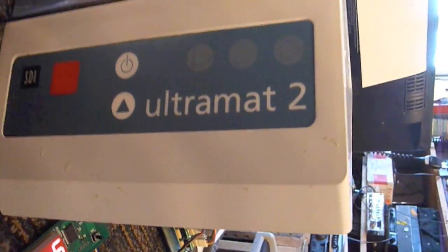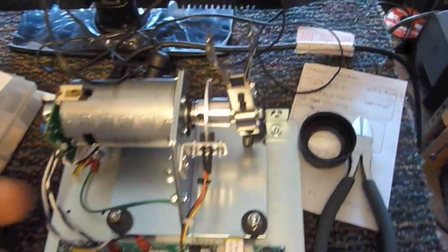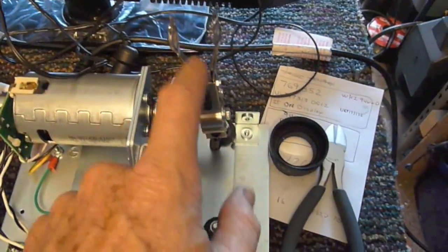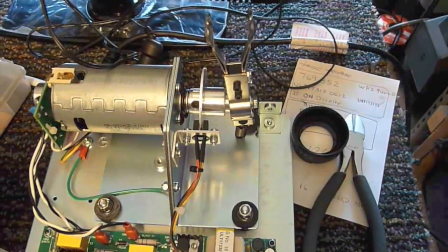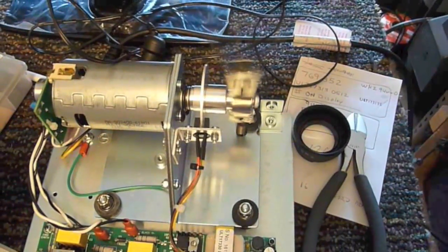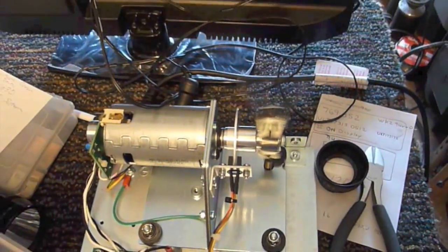So today I've got some dental equipment I'm working on. It's one of those machines that shakes up the amalgam and they put it in this little holder right here. And let's see if I can get this thing to work. Show you what it does. There we go. Shakes up the amalgam before they put that poison in your teeth.